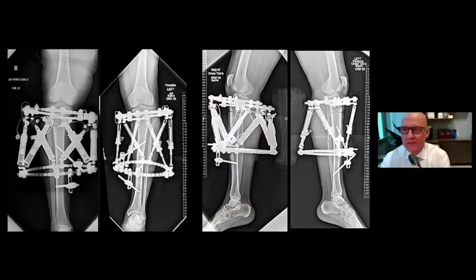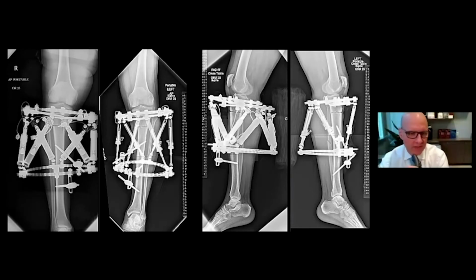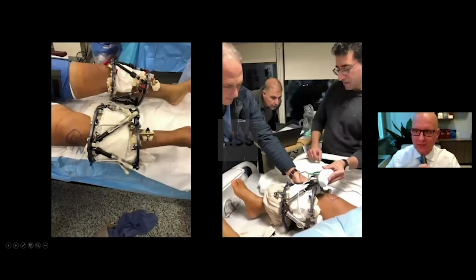Here's a guy who has bilateral genu varus, and we performed bilateral simultaneous corrections of varus and some sagittal plane deformity. I'm not going to get too much into the measurements and all that, but what I want to show you is we used OrthoSpin on one side, manual struts on the other side. So this is what I call a randomized control trial of one, which can be pretty helpful because that same guy is judging both sides.